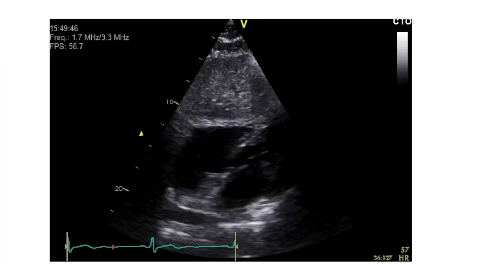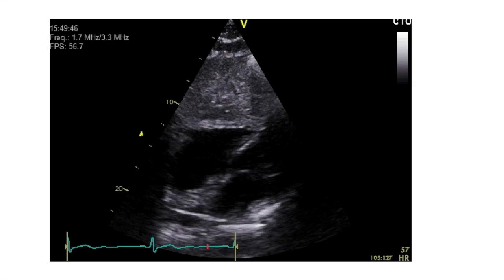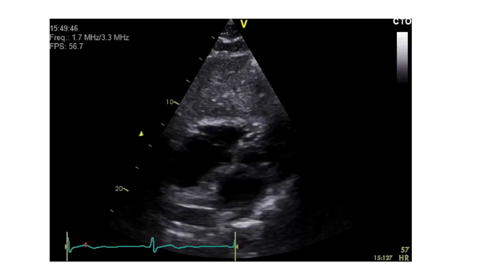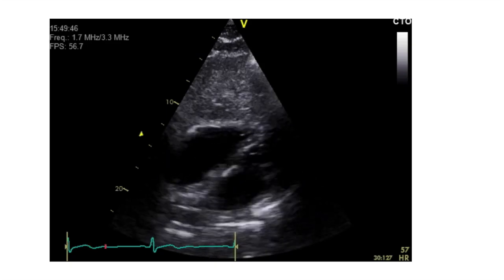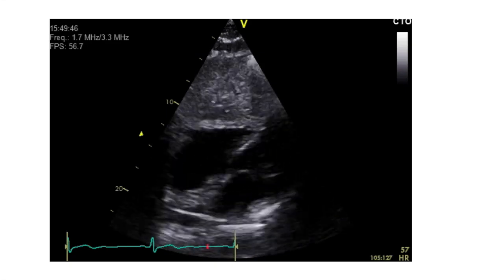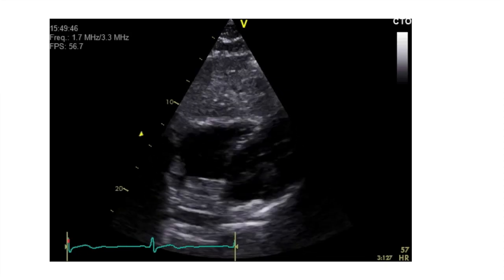Moving on to the subcostal 4-chamber view, this is the kind of view you get, sometimes better, sometimes worse, and in many ways it doesn't add a lot to the other views because it doesn't accurately represent the right ventricle size or shape very well, because it really depends how you slice the right ventricle with your beam. What it does do, however, is allow you to gather information on 2 important aspects.